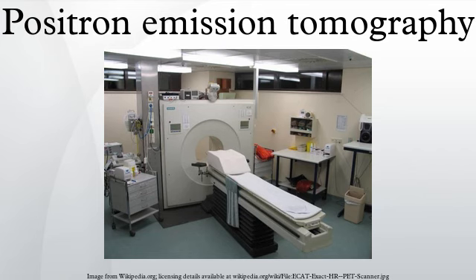Limitations: the minimization of radiation dose to the subject is an attractive feature of the use of short-lived radionuclides. Besides its established role as a diagnostic technique, PET has an expanding role as a method to assess the response to therapy, in particular, cancer therapy, where the risk to the patient from lack of knowledge about disease progress is much greater than the risk from the test radiation.